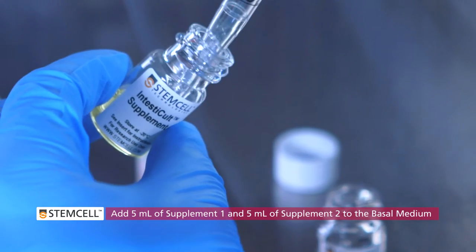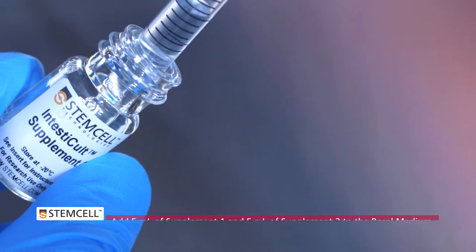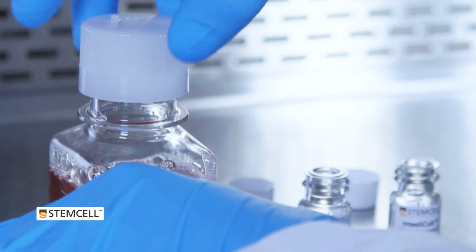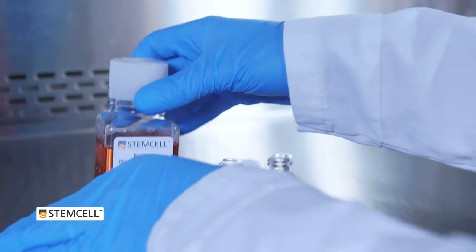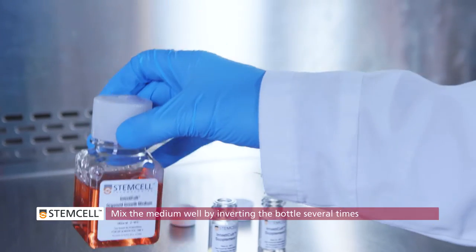To make the complete medium, add 5 mL of Supplement 1 and 5 mL of Supplement 2 to the bottle of Basal Medium. Replace the cap and mix the medium well by inverting the bottle several times. The medium must equilibrate to room temperature before use.